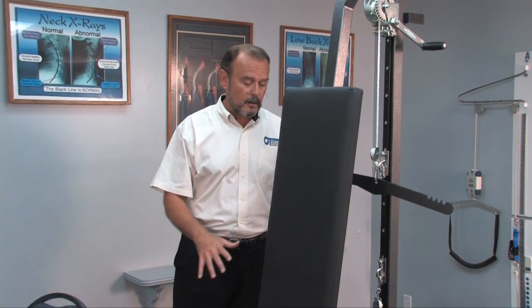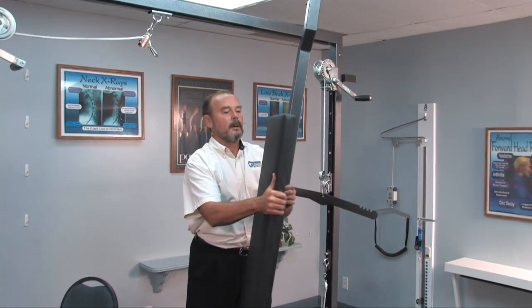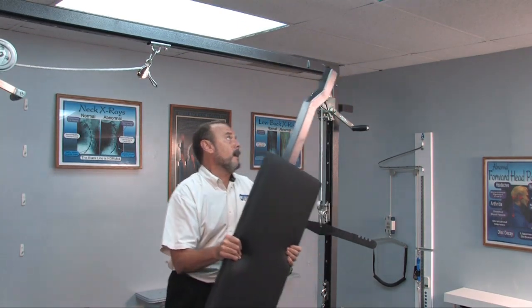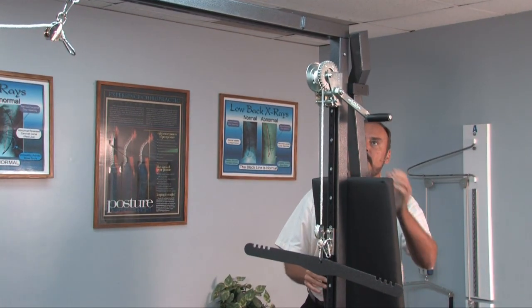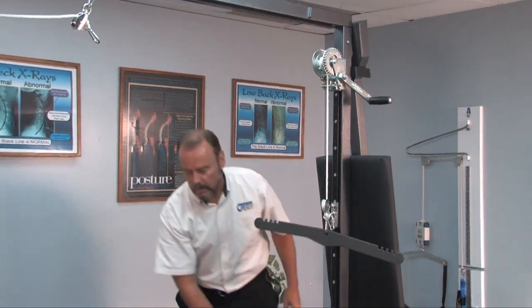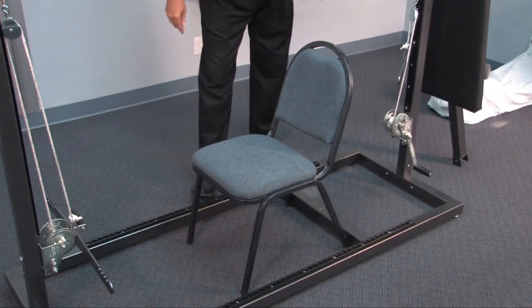Now, to change the standing unit into a seated unit for seated cervical traction, all we have to do is take the back pad bar off. We're going to take that and place it right back into that bracket right back there to hold it into place. Then we're going to go ahead and place a chair in here and use the chair for our seated traction setup.